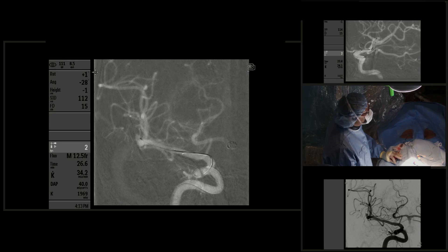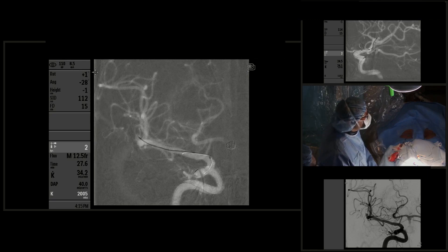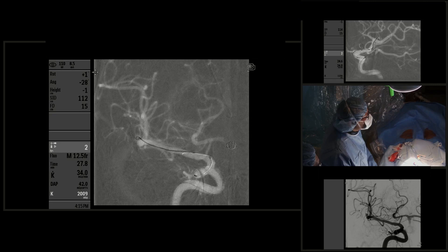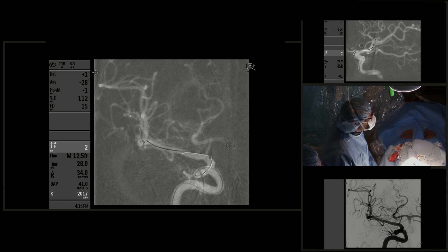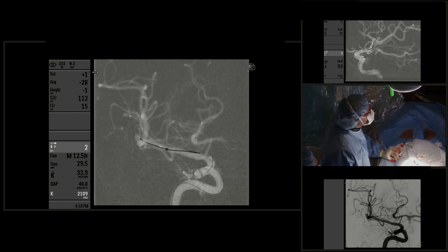You can see that we're navigating the microcatheter into the small aneurysm. The coil chosen was a 2.5 millimeter by 4 centimeter Cosmos 10 coil — a spherical coil that should stay inside the aneurysm. However, you can see how the coil is protruding into the parent artery, so we had to remove the microcatheter and use the distal access catheter again for better support.